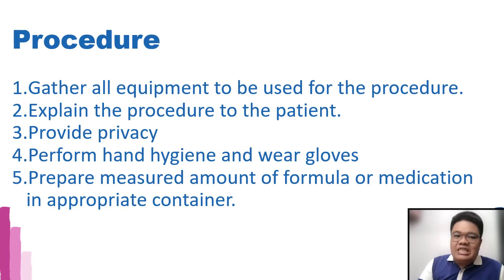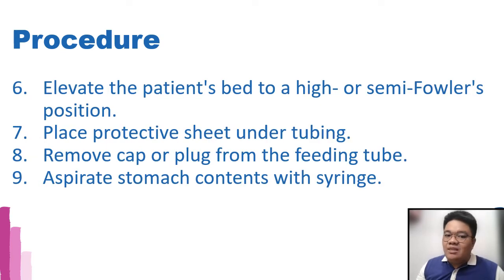Provide privacy, and then you perform your hand hygiene and wear your gloves. Plus, you prepare the measured amount of formula or medication in an appropriate container. Okay? Then, you elevate the patient's bed to a high Fowler's or semi-Fowler's position. What is the purpose? Why do I need to elevate the patient's bed to that position? So class, your high Fowler's position or your semi-Fowler's position is to prevent, okay, the aspiration of the fluid going to the lungs of your patient.